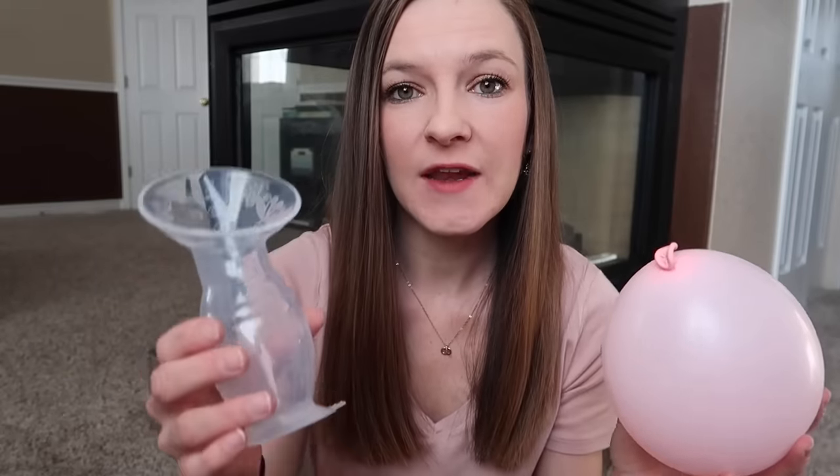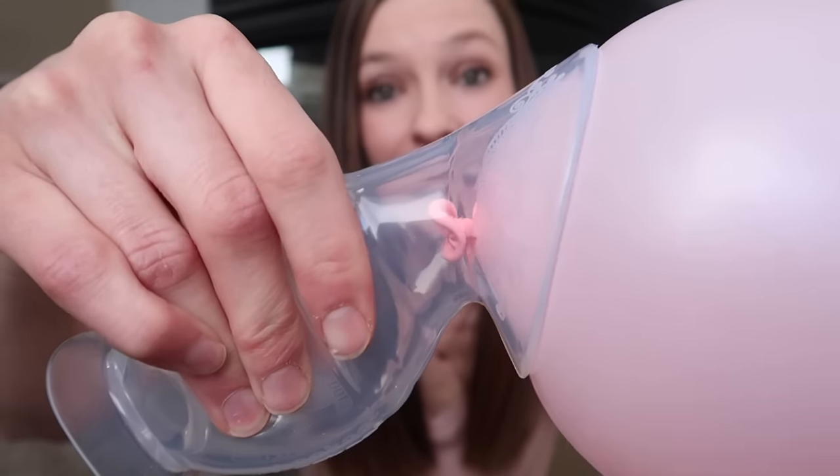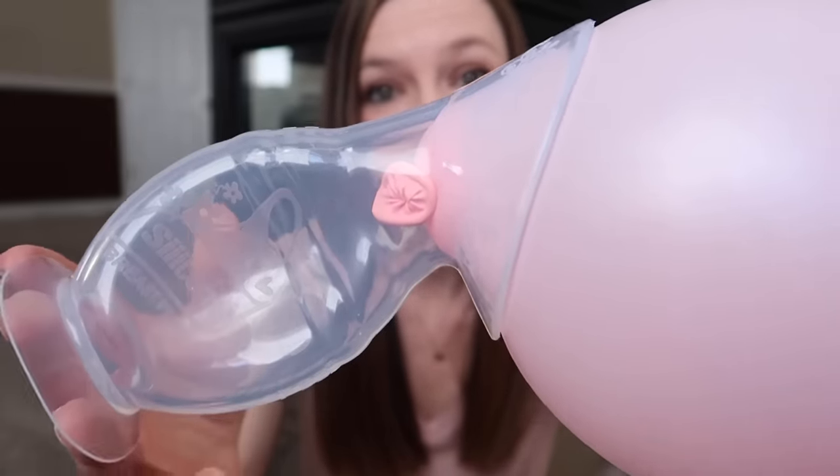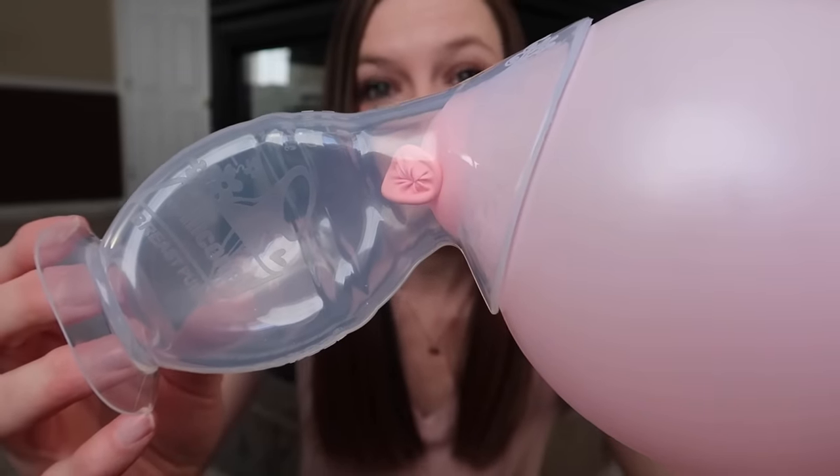The way that a Haakaa breast pump works to actually extract milk is it uses suction. I'm going to demonstrate with my handy dandy balloon boob. All you need to do to attach a Haakaa to your breast while you're breastfeeding is to squeeze the pump itself at the base, then attach it right over where the nipple is and let go. It does kind of suction the nipple and the areola out into the breast pump, and that's when the actual suction process begins.